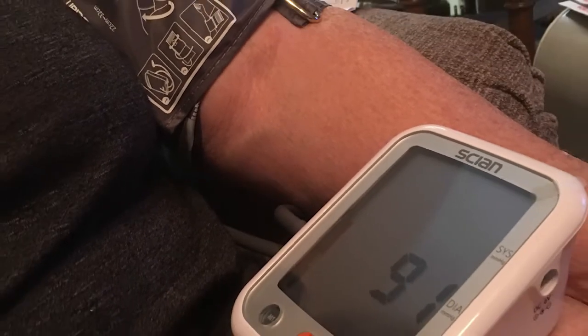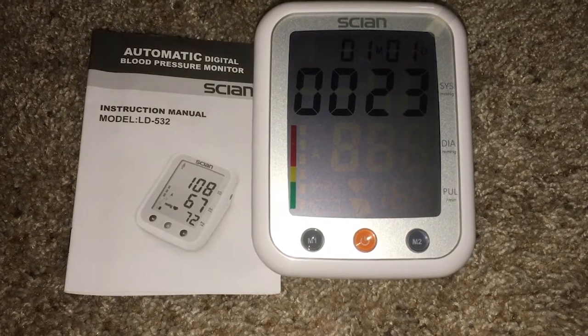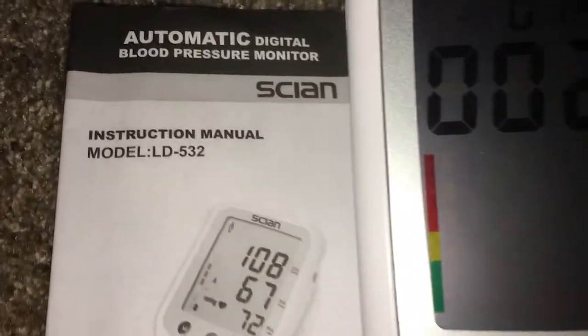Some of the things I like about this blood pressure checker is how big the screen is, how bright it is, and how easy it is to read the readouts of the results.